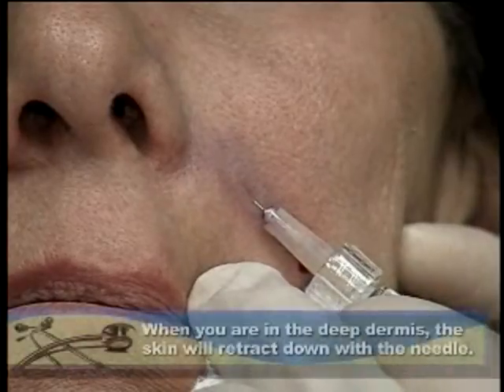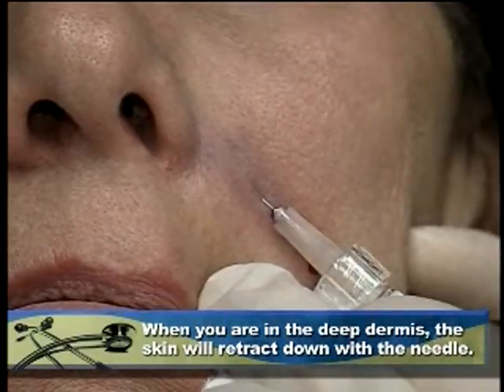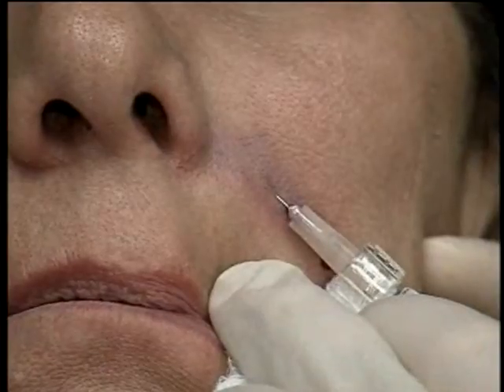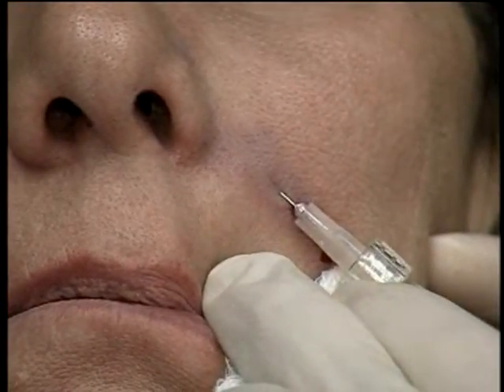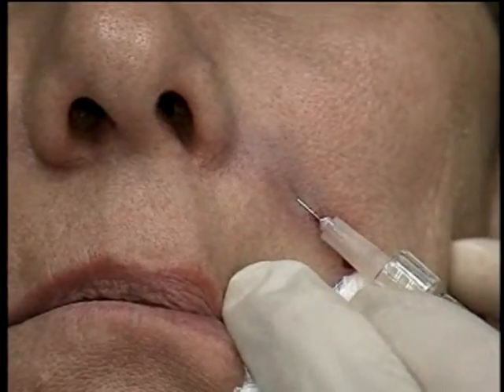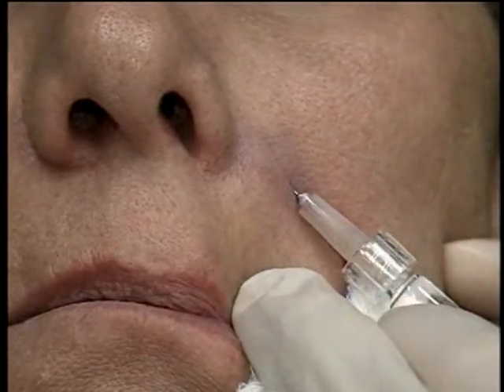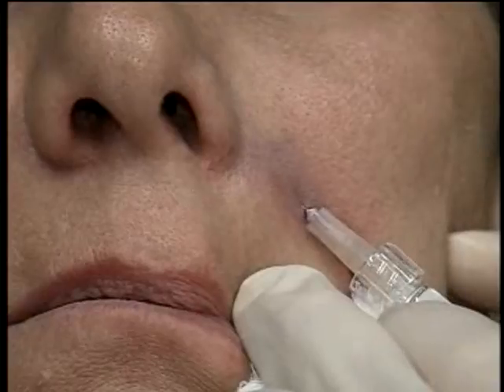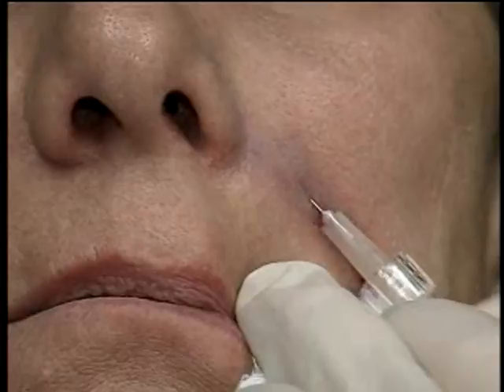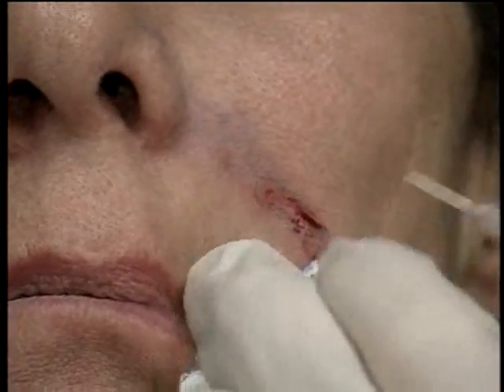The deep dermis is about here, and you can tell you're in the deep dermis because when I push my needle down, the skin will go down with it. It's retracting the skin down. That's in the deep dermis. This is the area of placement which is recommended by most practitioners and even by the package insert, and that is also in the FDA indication. I believe putting it in the subdermis, which is a little bit deeper, and you can feel a little give when you get into the subdermis. See, the skin doesn't retract down as much. I'm no longer in the deep dermis, I'm in the subdermis, and I like to place it in that area, going back and forth, filling it in.